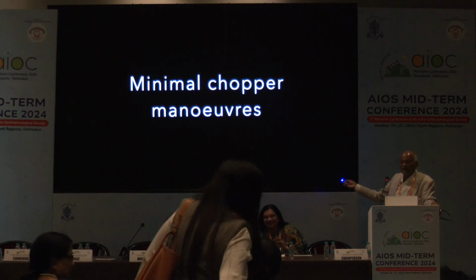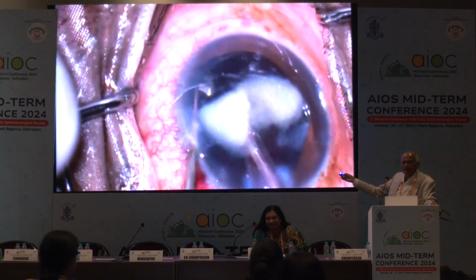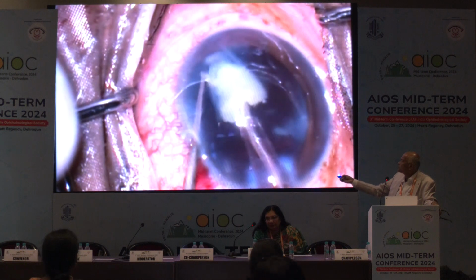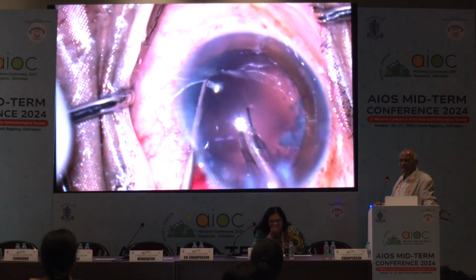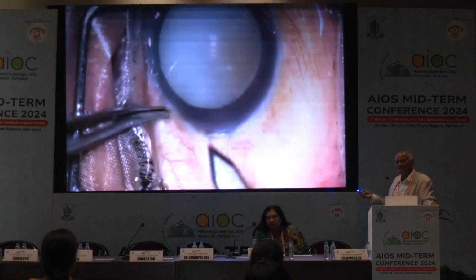And now what I was telling you, the last piece, the chopper movement should be minimum. See here, minimum. I have reduced every parameter. Can you see this? Stand still. I have reduced it because I have made it my habit to do it. And once I have made it a habit, then that is possible.